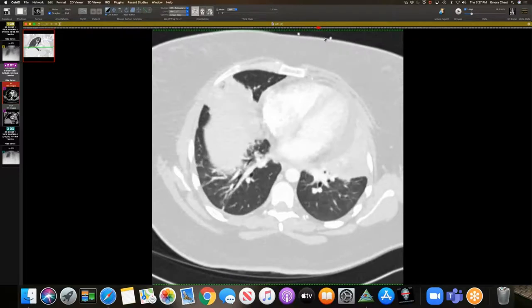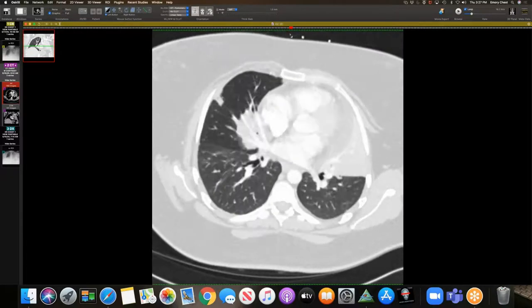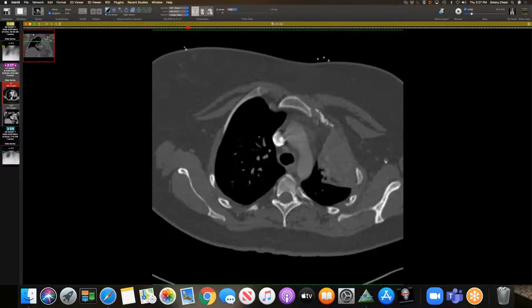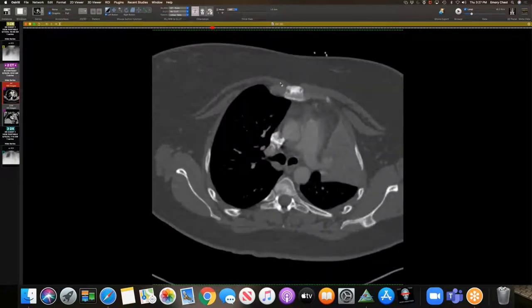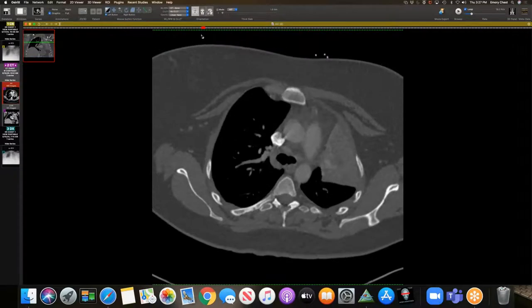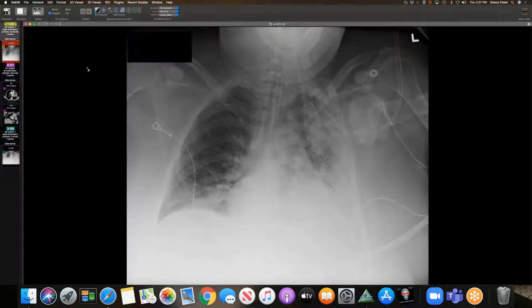So I'm not sure if these nodules are a form of organizing pneumonia, or if they're related to bronchopneumonia with the MRSA infection. And then this consolidation could obviously be MRSA. The other thing you can see is it seems like she's been aspirating also. You can see in the left bronchus there's some debris lying there. But this is a case of a young patient with COVID, superinfected with MRSA. And she's still intubated in the ICU. You can see consolidation still there.